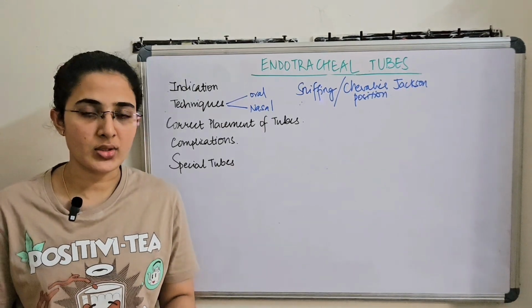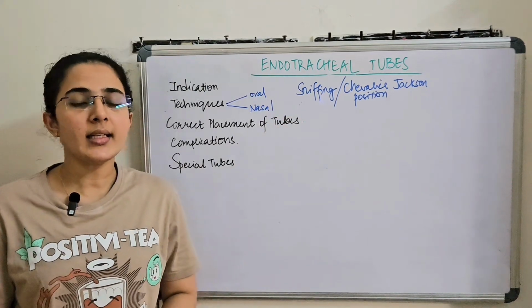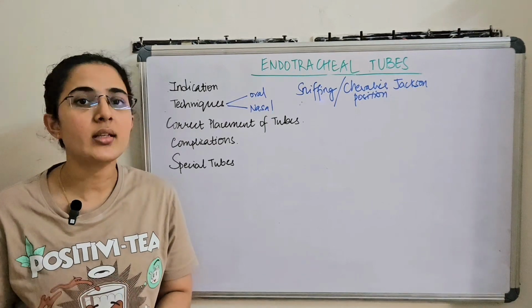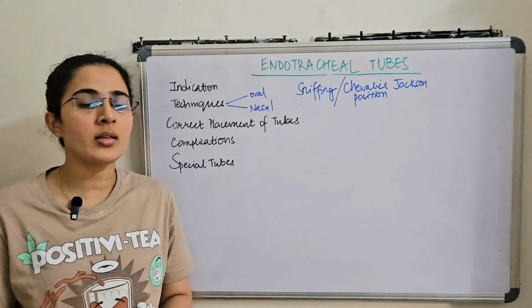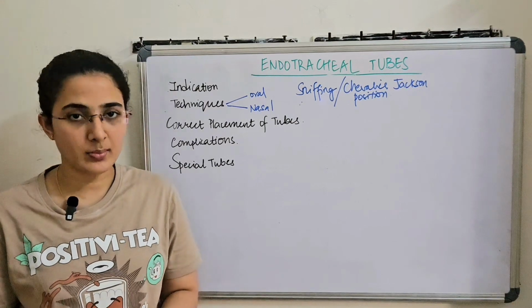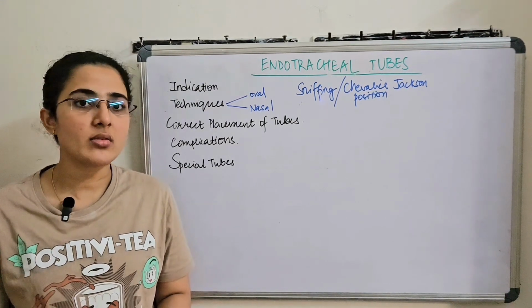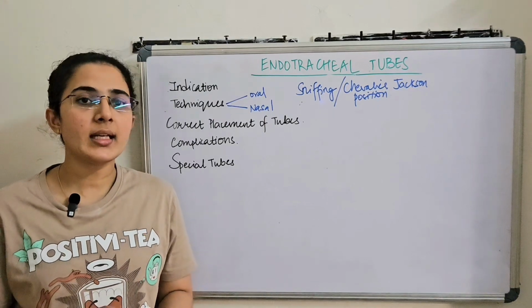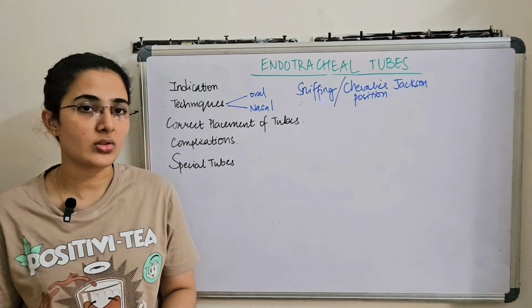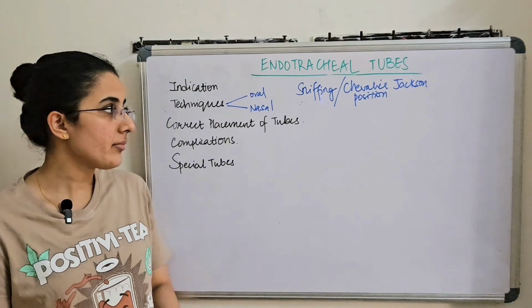nasal intubation. When we are doing a nasal intubation, the technique is that, first of all, we have to select the nostril that is wider, without a deviated septum, that is, without deviation to that side. We should also ensure that we put in vasoconstrictors beforehand and lubricate the passage well, in order to reduce any trauma to the nasal structures when we are passing the nasal tube.